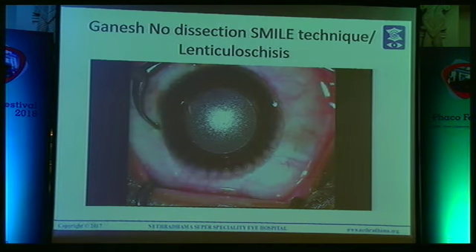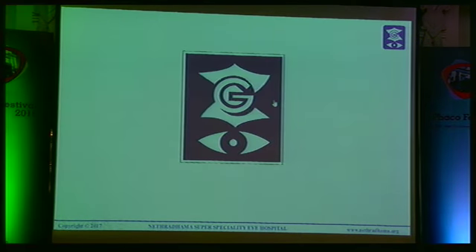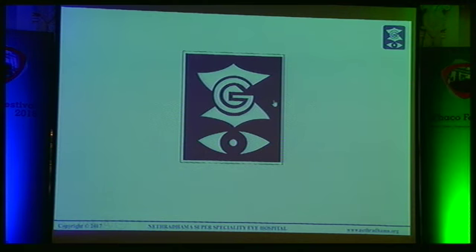So the prerequisites for this particular technique are that the energy must be very much optimized, and you should not have any black spots or opaque bubble layer, and also the lenticule.